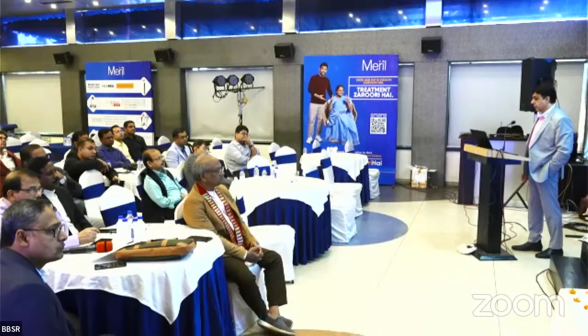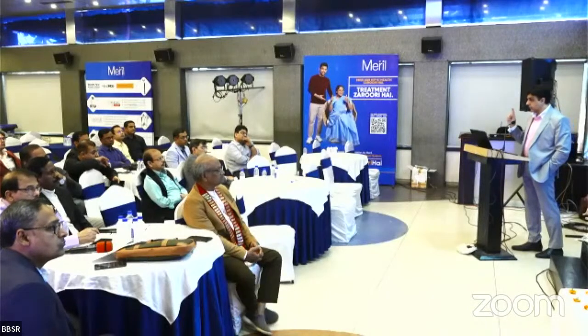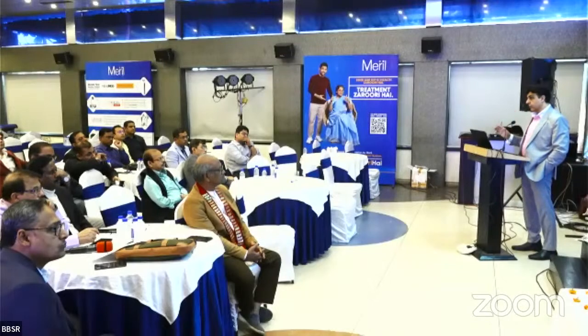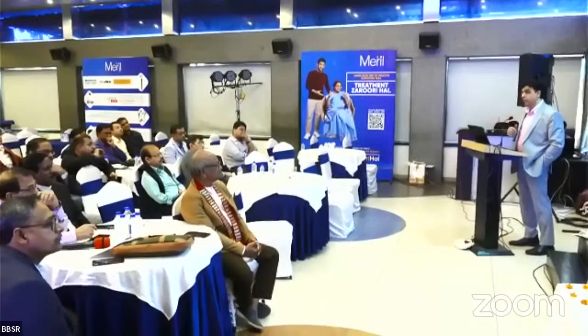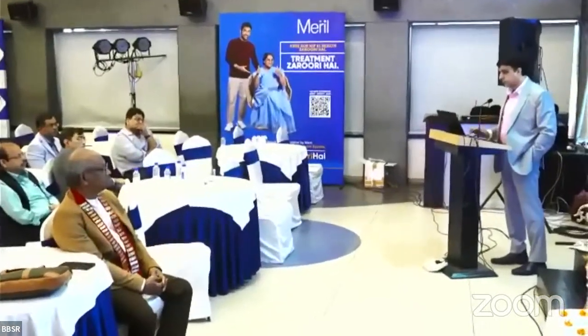These are again the systems where exposures are number one, the most important part. Getting onto a viable piece of bone is point 2. Point 3 is the zone 2 and zone 3 fixation. You need to be very particular about these things. And she is still doing well.